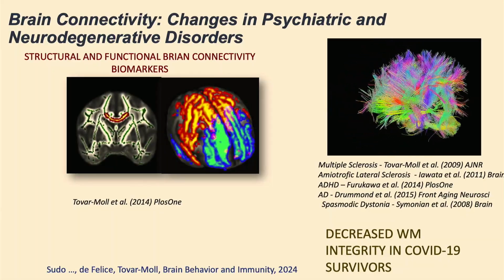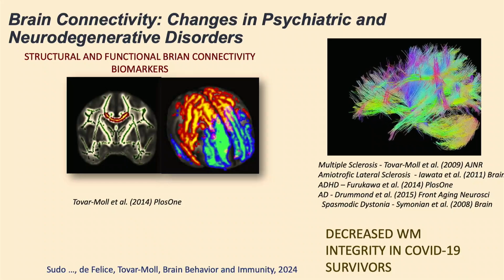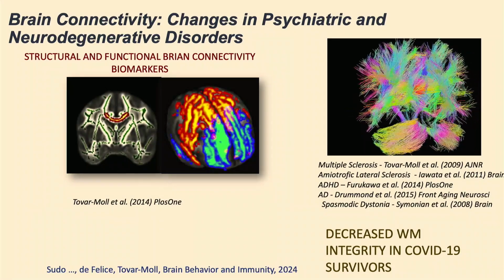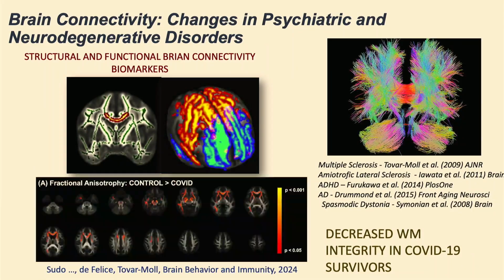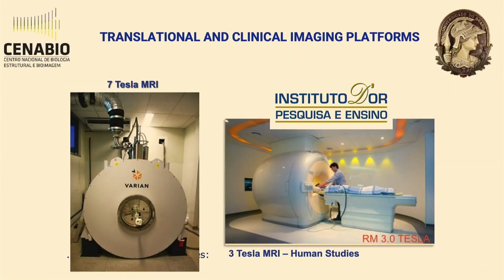This is actually my field, so I work with brain connectivity, and we apply those techniques to understand brain development and also neurodegeneration in different disorders, and even apply them to things that just arrived. These are just examples of brain imaging. You all know about long COVID, and we studied this too. Those are areas where there are white matter changes in patients who developed memory impairment and executive impairment, and we see those as well.